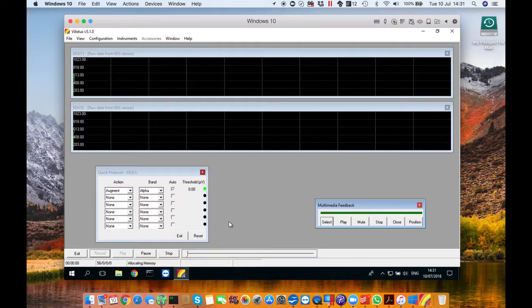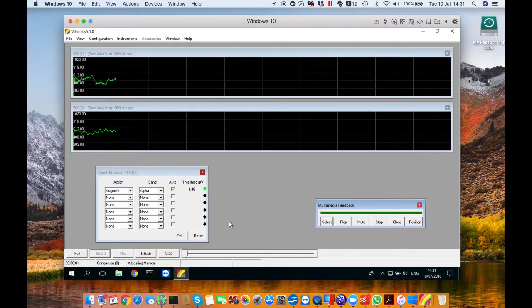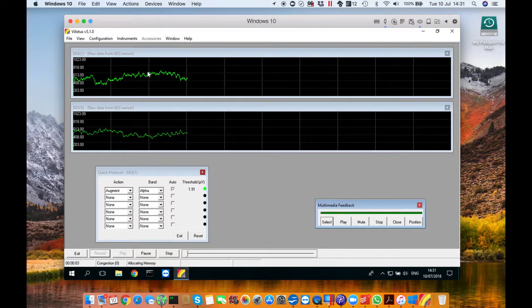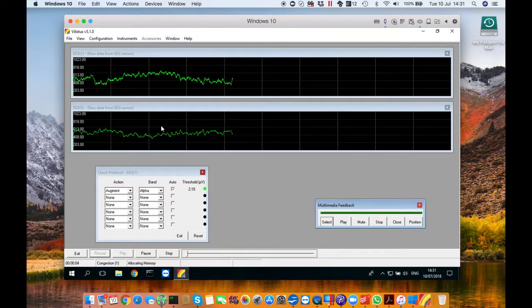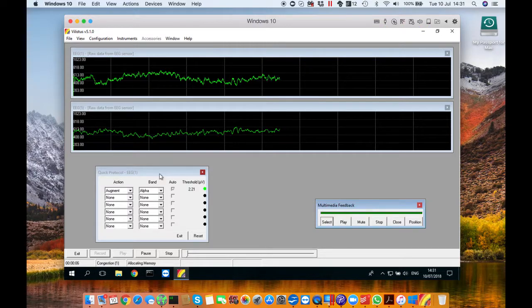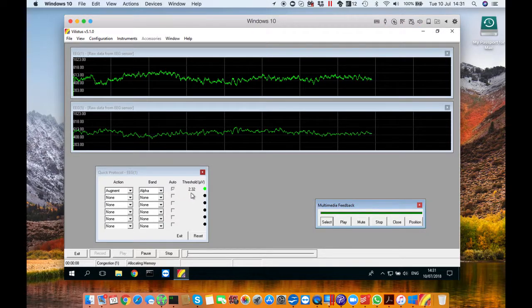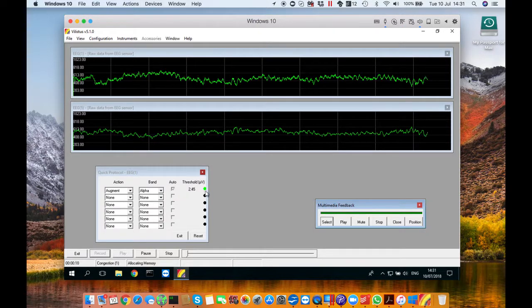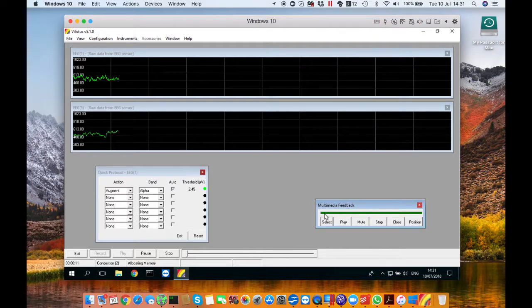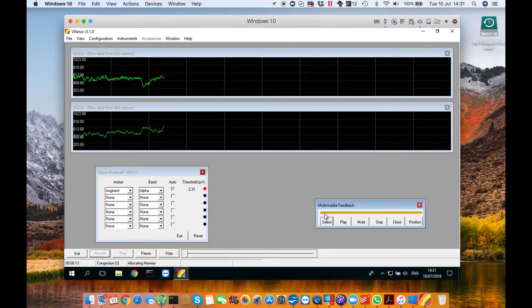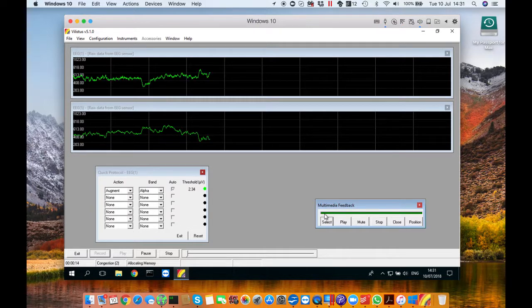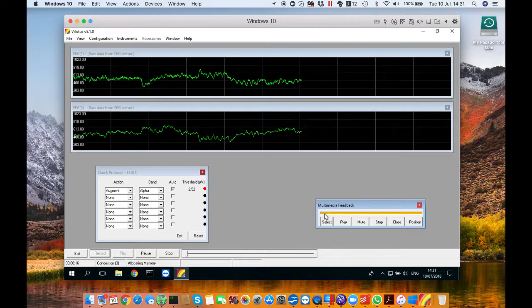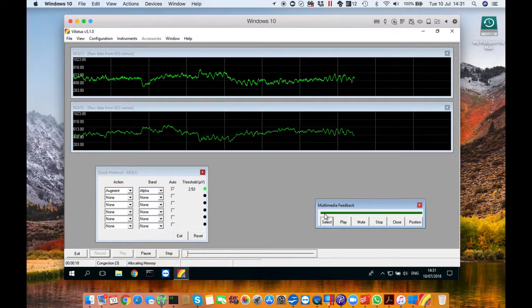So you'll see at the top in the graphs an example of good signal. Bad signal will be much more volatile it'll be going up and down so you want to be aiming to keep it going along in the center. And then you'll see in quick protocol threshold that number going up and down is pushing you so that your alpha waves will stay at a certain level and the little red dot or the green to red dot when it turns red it means that your alpha waves have gone below that and you've got to try and push it back up.